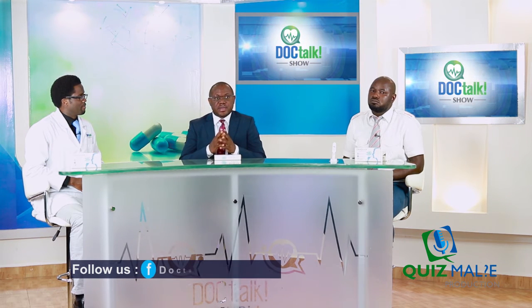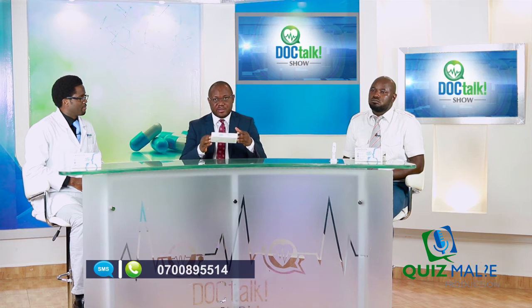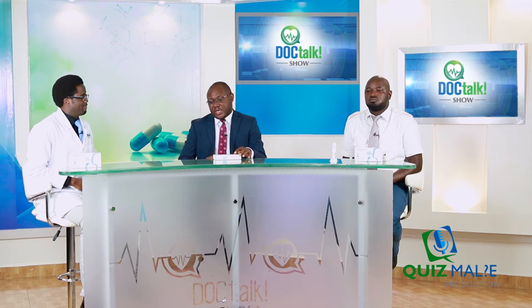And currently in our program, it's actually the other way around, that some people do test positive on the self-test, and then when they come for confirmation to the hospital, they turn negative. Because our strategy is such that if the HIV self-test is positive, then you come for a confirmatory test by a healthcare provider. So there's a chance that 1% may be a negative. So there's a chance that it may be a wrong result.